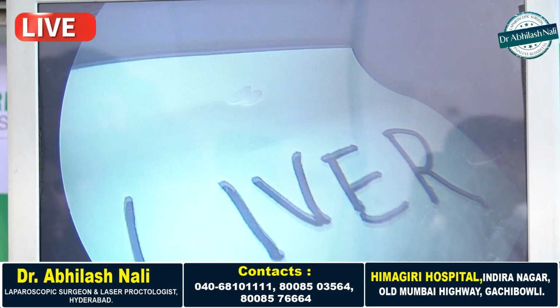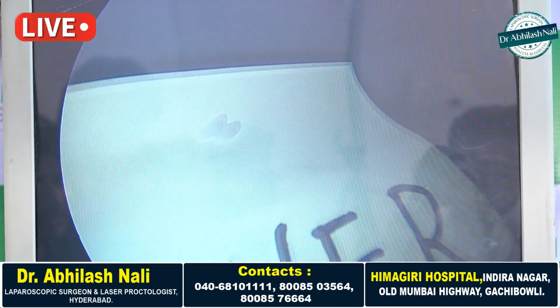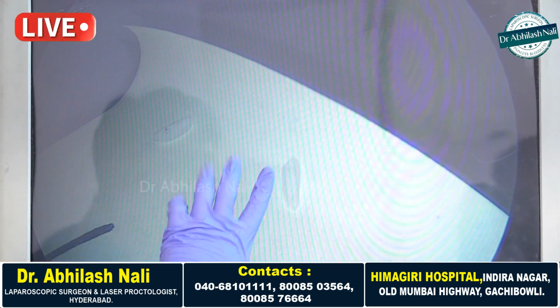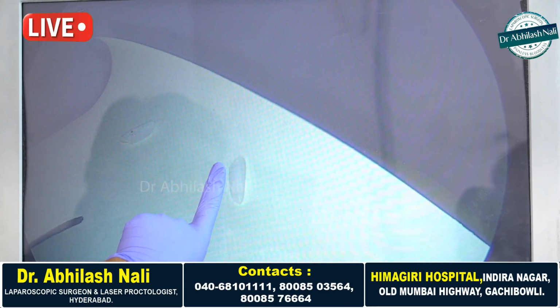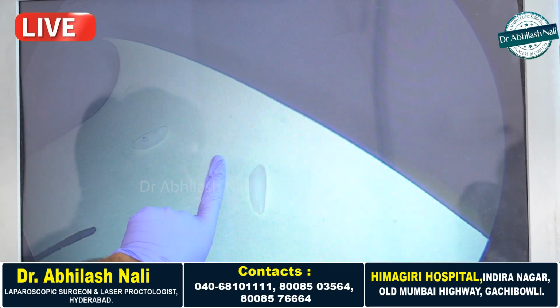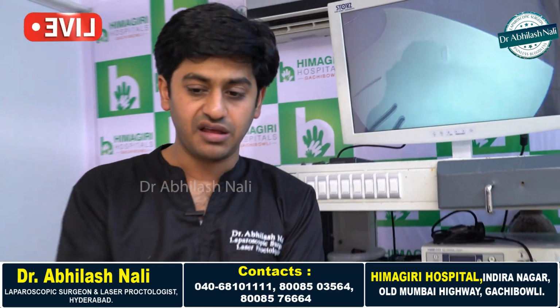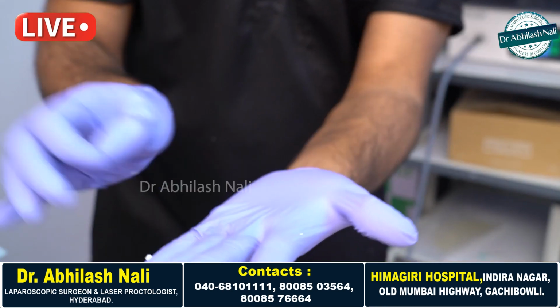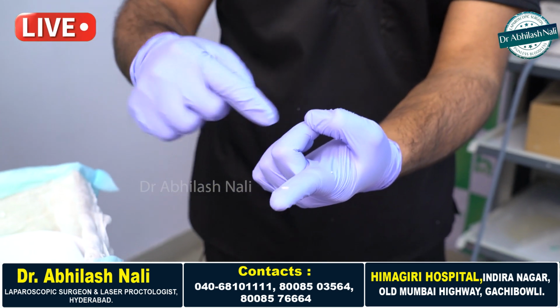So the same rice grain which we have seen earlier, you can see how big it appears. Through this laparoscopy, even the small grain appears literally as long as my index finger. This is the advantage of laparoscopy. If we compare side by side, the small rice grain which was seen inside is nowhere compared to the length of my index finger.